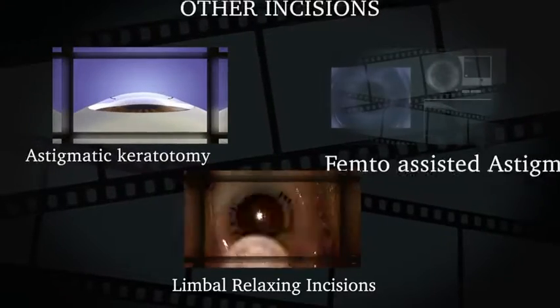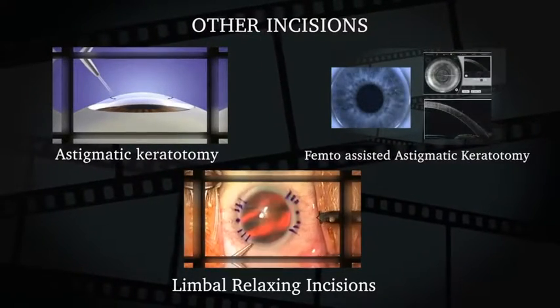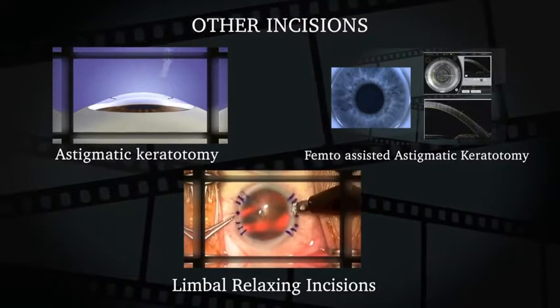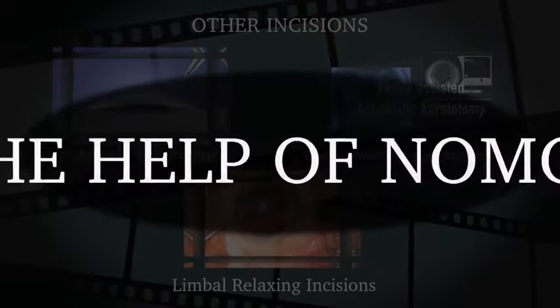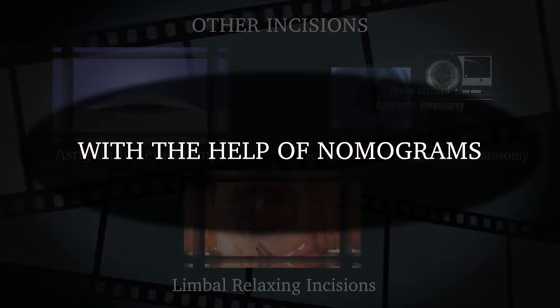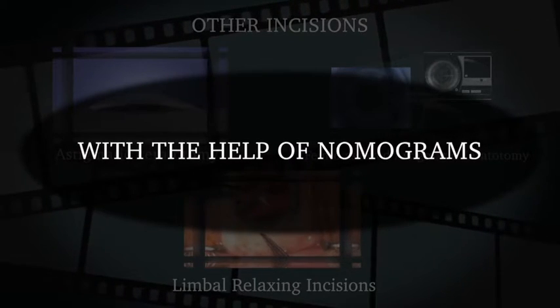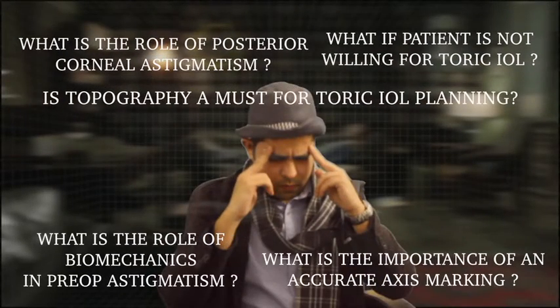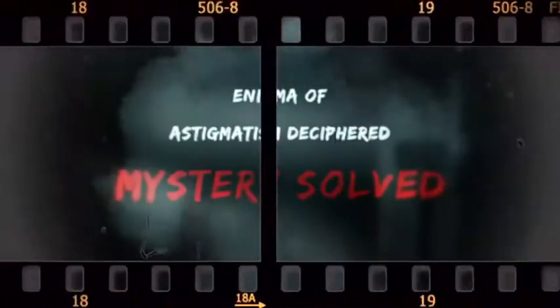We have a number of corneal incision-based options like astigmatic keratotomy, femto-assisted astigmatic keratotomy, and limbal relaxing incisions. We can use a number of nomograms which are available online freely and plan the incisions accordingly to manage astigmatism. Thus, Dr. Holmes rightfully solved all the queries of ophthalmologists all over the world. Hence, mystery solved. He has finally deciphered the enigma of astigmatism preoperatively in cataract surgery.